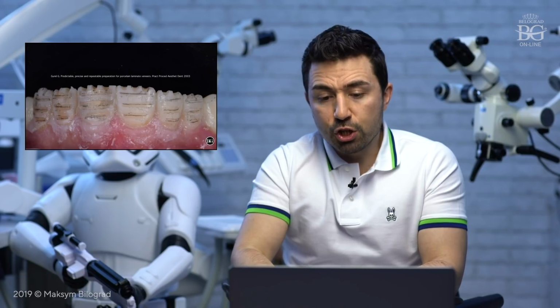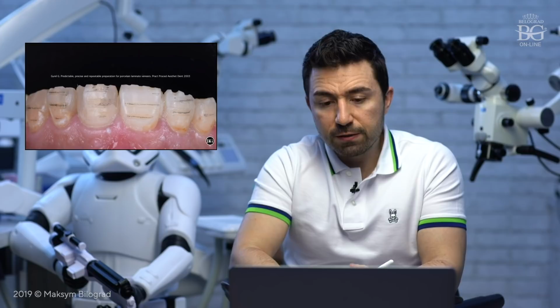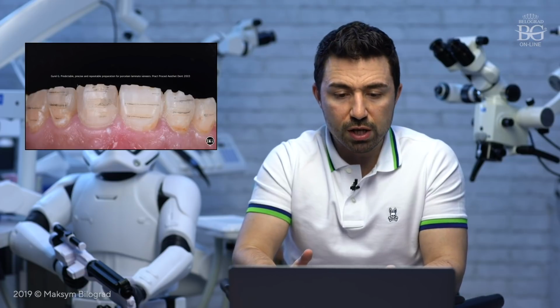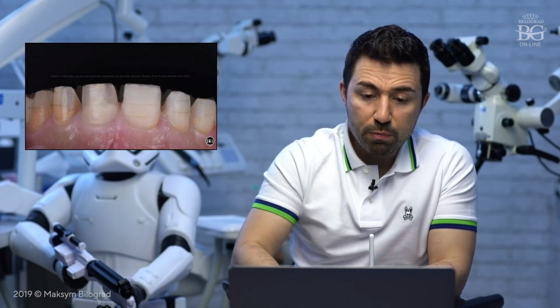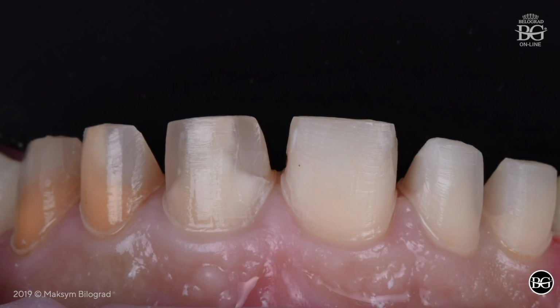Okay, so we made these grooves. Okay, we made these grooves, then we removed the mock-up, and now you can see how far we went into the sound tooth structure. So in this case, a pretty minimally invasive case. Then we prepped. This is step 1 finished. We finished step 1, and then in that case we had to replace old composite fillings that this patient had.